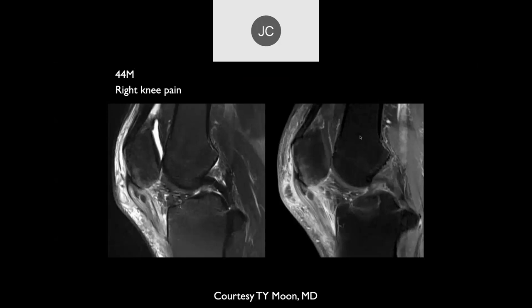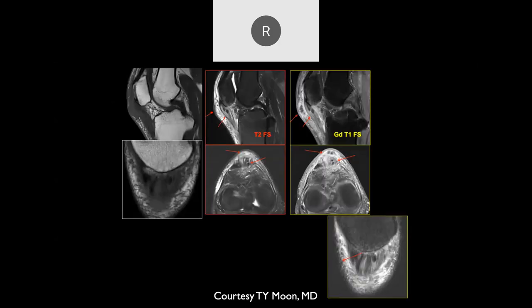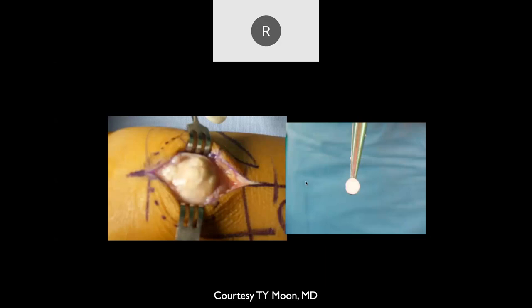A 44-year-old with right knee pain shows extensive prepatellar edema, a thickened and edematous patellar tendon, and two foci of low signal intensity — these are tophi. There is some edema at the inferior pole. At surgery, two small tophi were pulled from the tendon. This is tophaceous gout.